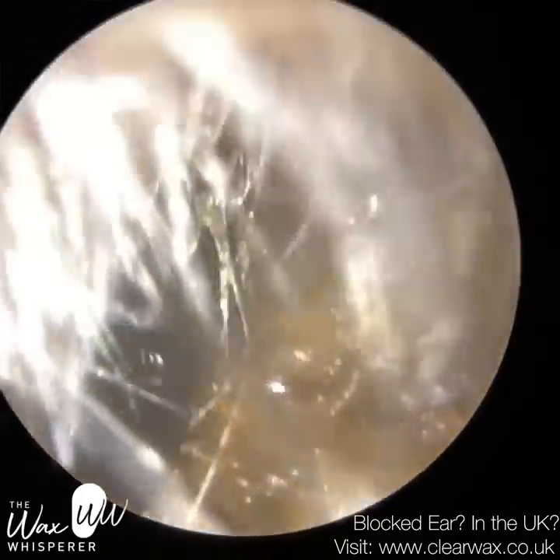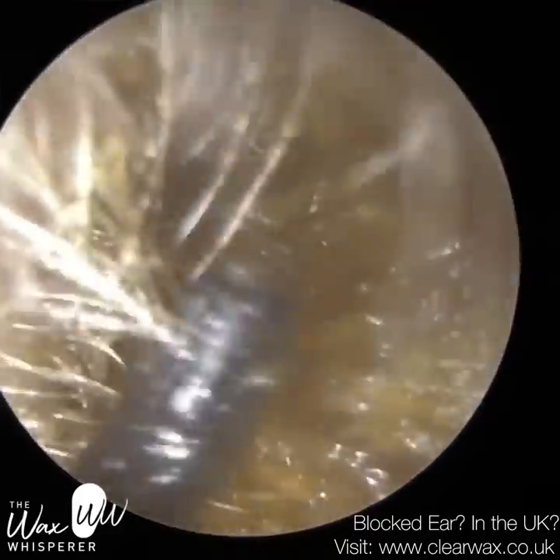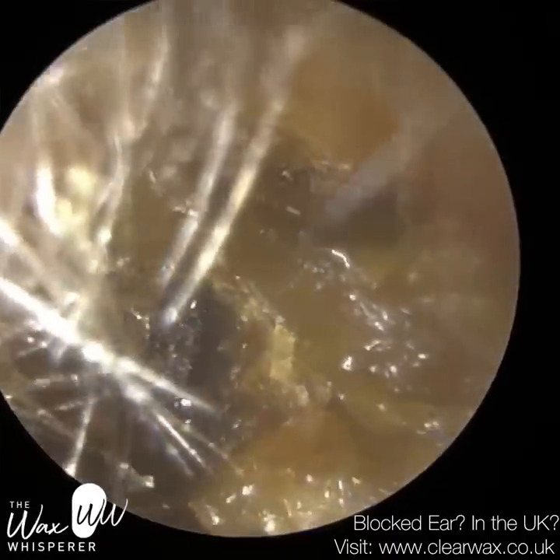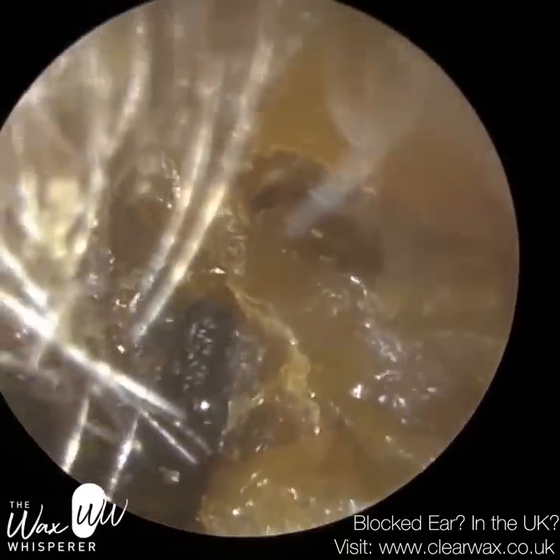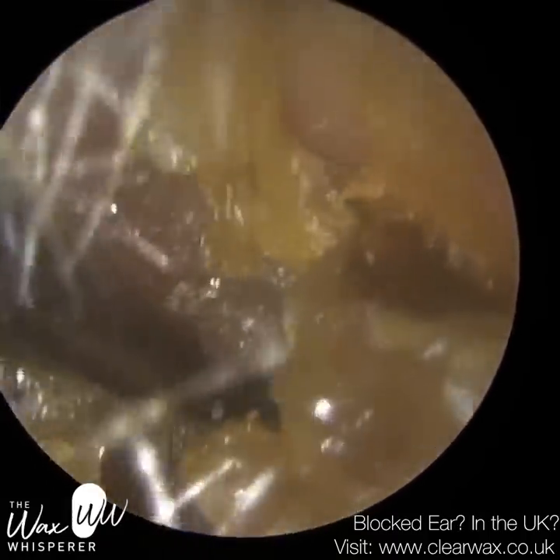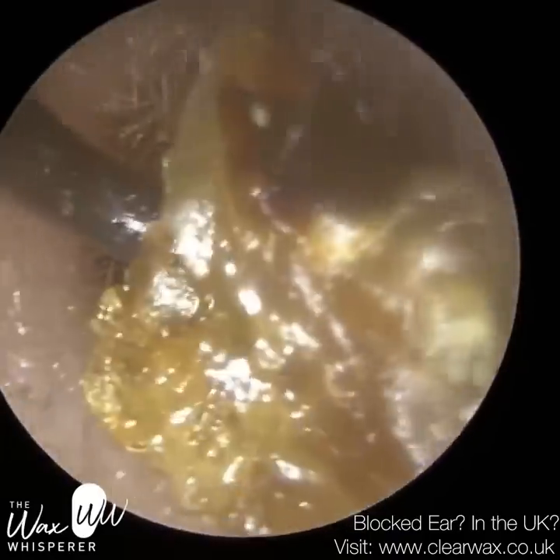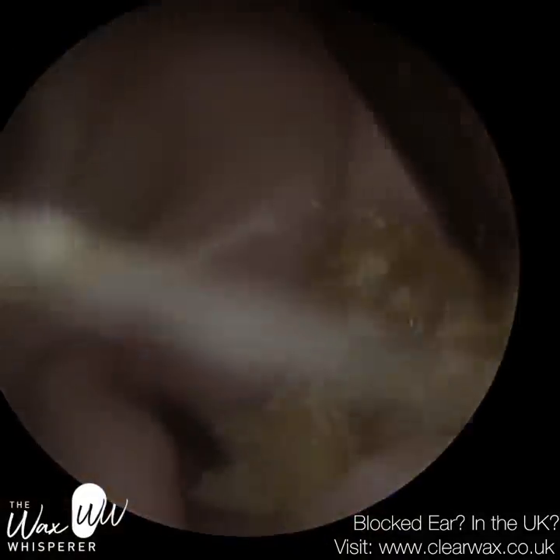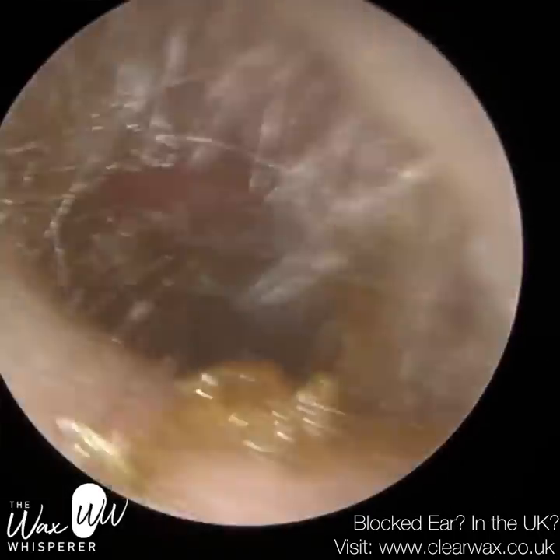So I'm just loosening it around the edge. You could have also used the forceps for this, but with the earhook I had a bit more manoeuvrability. With the forceps you're just going to grab it, but with the earhook you can manipulate the plug of dead skin as well. So I was able to push it down from the roof, loosen it and then bring it forwards.